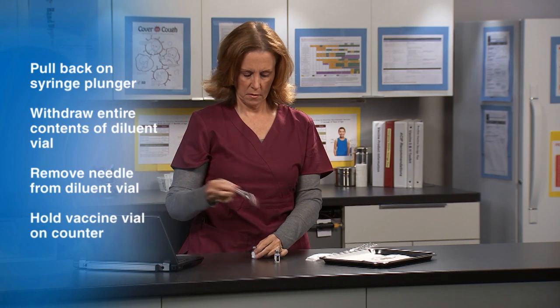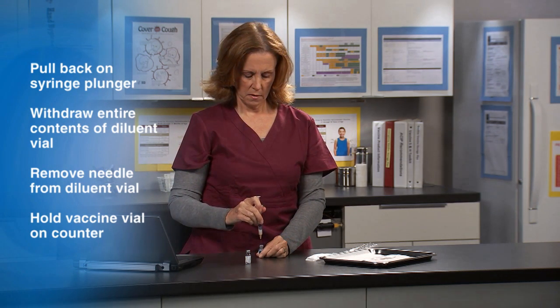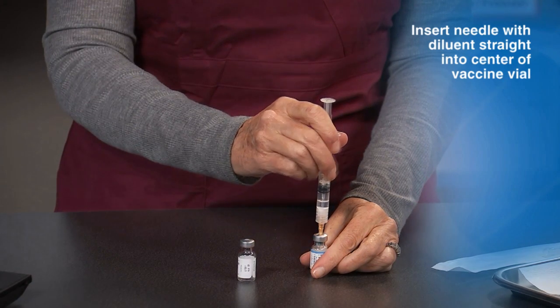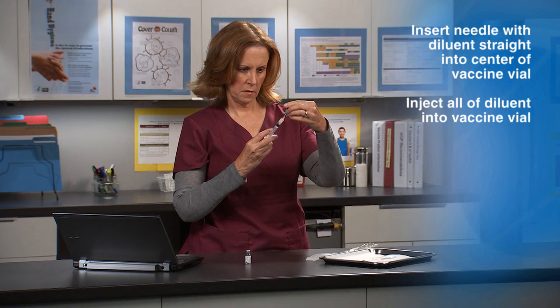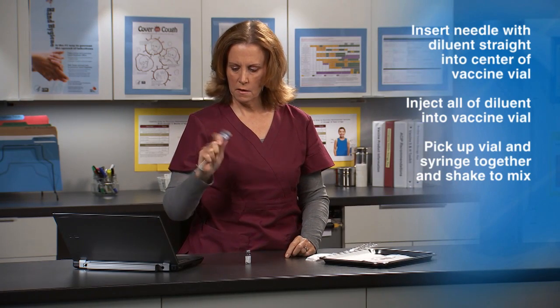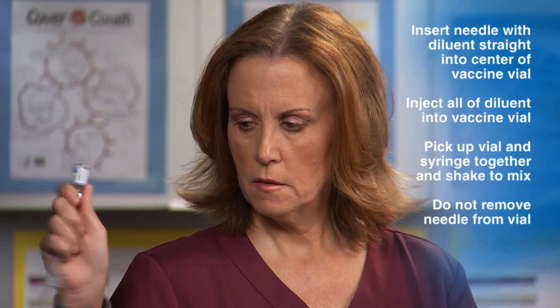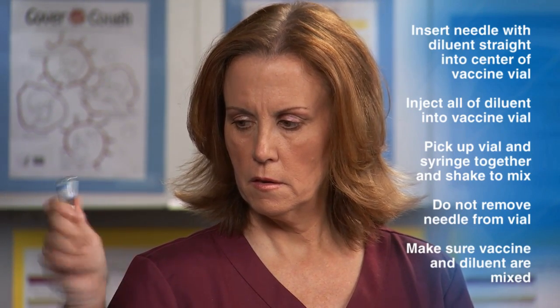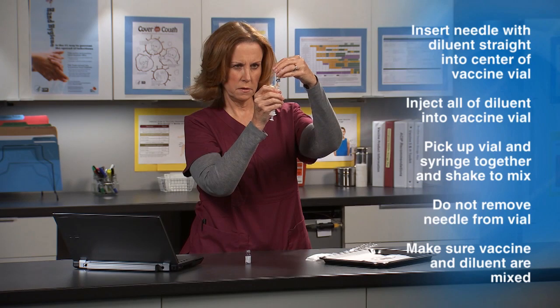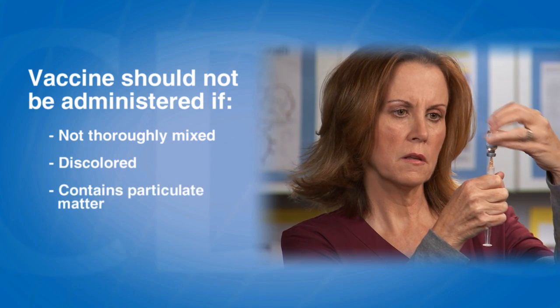Remove the needle from the diluent vial. Now hold the vaccine vial on the counter using your non-dominant hand. Insert the needle of the syringe containing the diluent straight into the center of the vaccine vial stopper. Inject all the diluent into the vaccine vial. Holding the vial and syringe together in your dominant hand, carefully agitate or shake to mix the lyophilized vaccine and diluent. Do not remove the needle from the vial. Inspect the vaccine to make sure that all the lyophilized vaccine has dissolved and is mixed thoroughly with the diluent. Make sure there is no discoloration or precipitate. The vaccine should not be administered if it is not thoroughly mixed, discolored, or contains particulate matter.